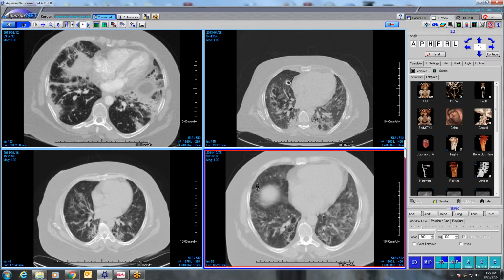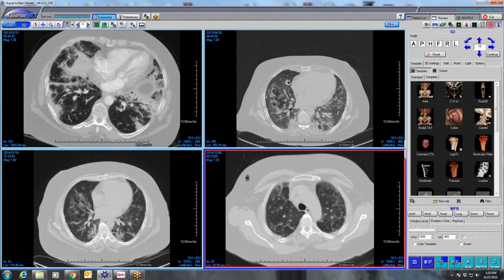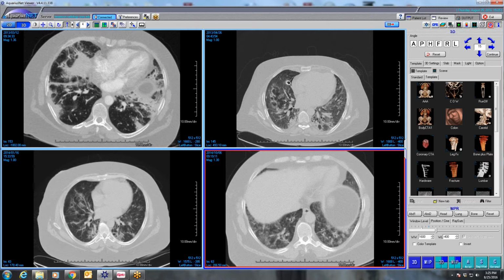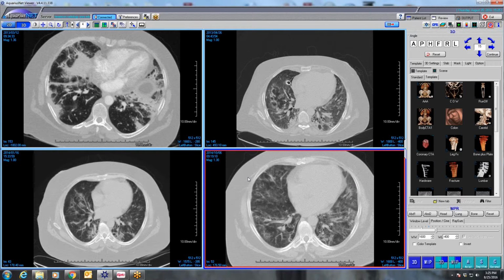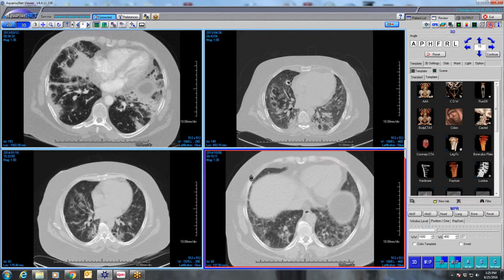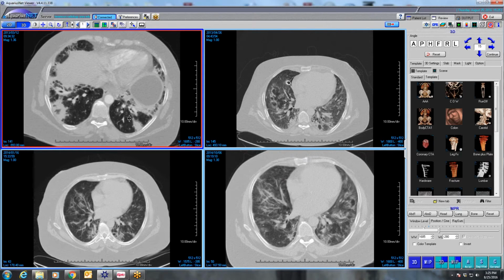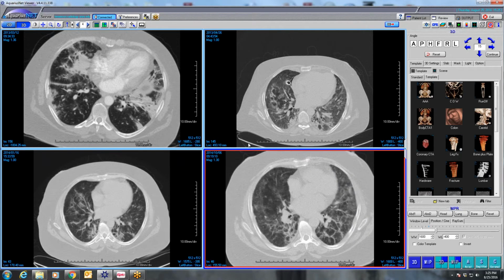And she kind of has this organizing pneumonia, fibrosis, whatever you want to call it, NSIP with organizing pneumonia. To me, this is more just organizing pneumonia progressing to some degree of fibrosis. Well, whenever they see the fibrosis with this, it usually is NSIP. Anyways, it's very interesting to see how some of these progress over time. We now have a large number of these cases of organizing pneumonia, sometimes cryptogenic, but most commonly due to some systemic inflammatory process, leading to this diffuse fibrotic process.